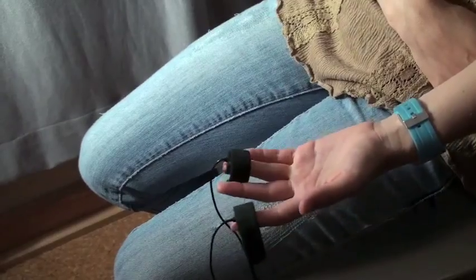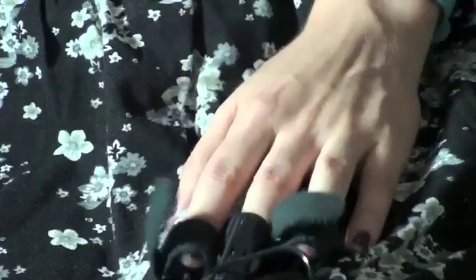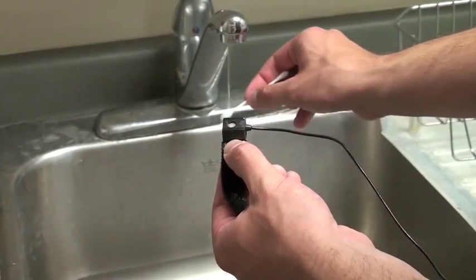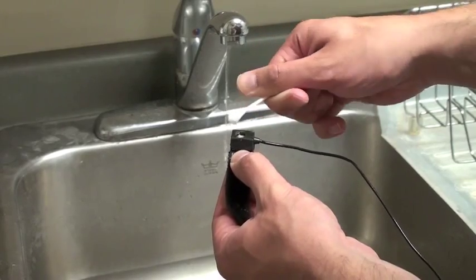Ask the participant to put their hand in a comfortable position, as they should not move it throughout the recording process. To clean the GSR electrodes, use Q-tips and lukewarm water. Soak the Q-tip in water to use for cleaning, just like you did for the EMG electrodes. Be very gentle and ensure that all gel is cleaned off.